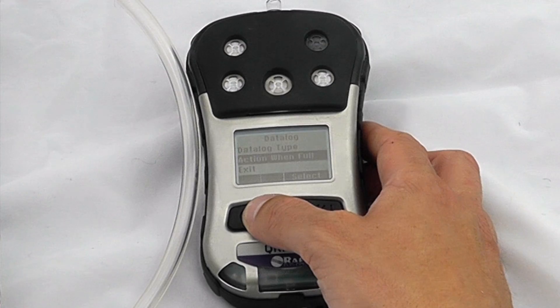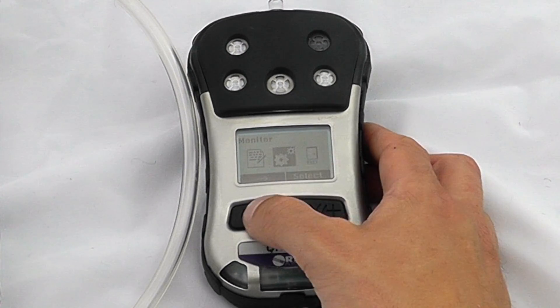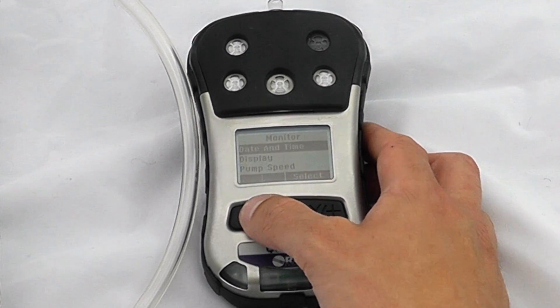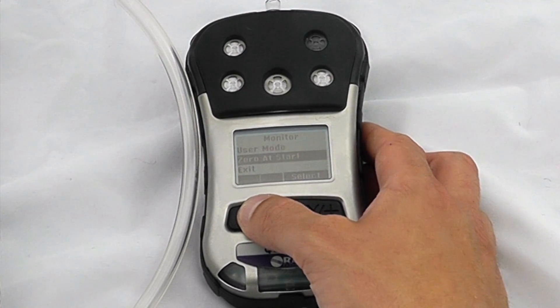You can also set what happens when the data log is full — whether it will wrap around or give an alarm and terminate — and then there are the general monitor setup options, which include date and time, display, pump speed, site IDs, and user IDs.